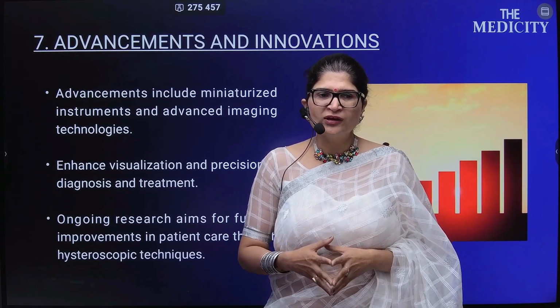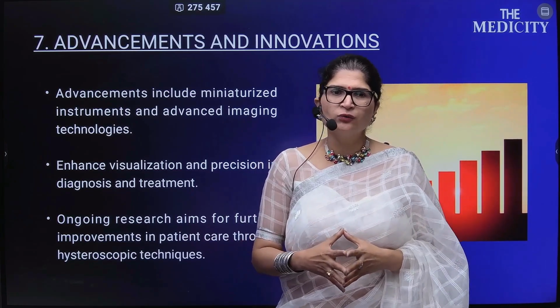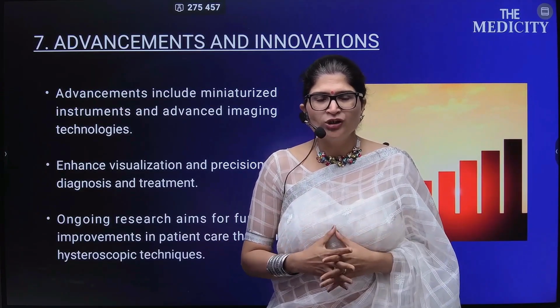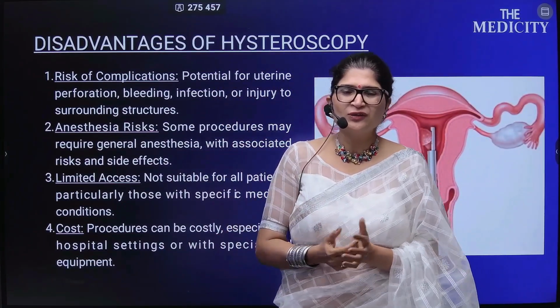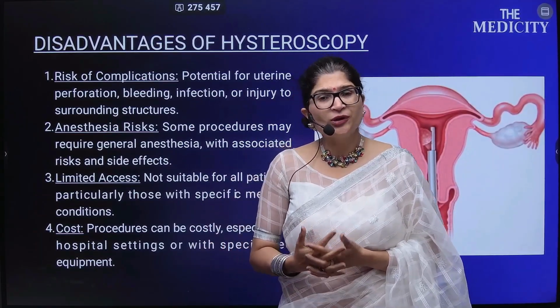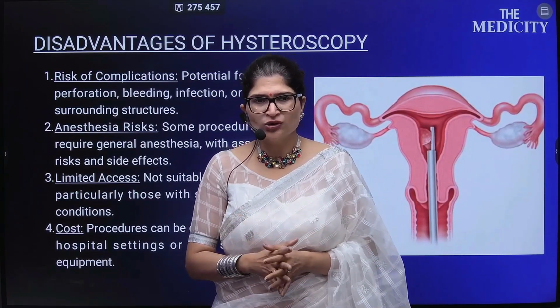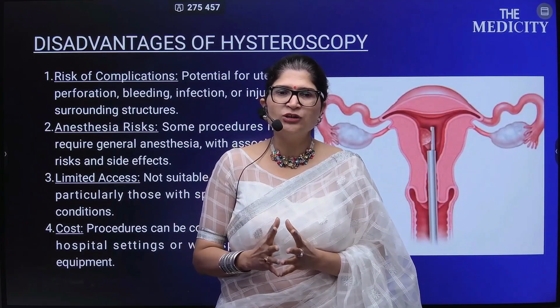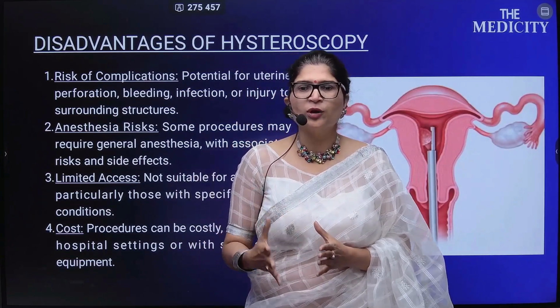We will be having more modifications on the instruments, and more indications and contraindications will come up with time, with all the innovations in the research going on in hysteroscopy, and we will be upgrading our knowledge as the advancement advances. With these advantages, there are a few disadvantages which I should not miss discussing. Risk of complications: there is a potential risk of uterine perforation, bleeding, infection, or injury to the surrounding structures. Anesthesia risk is not to be forgotten. Some procedures might lead to complications because of the general anesthesia used, and that has to be properly dealt with.